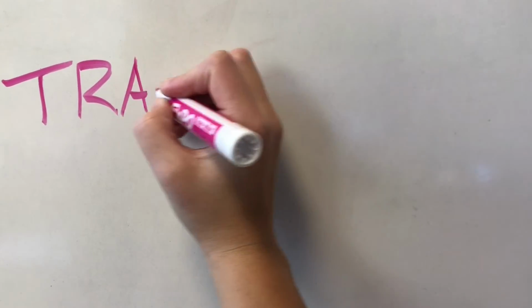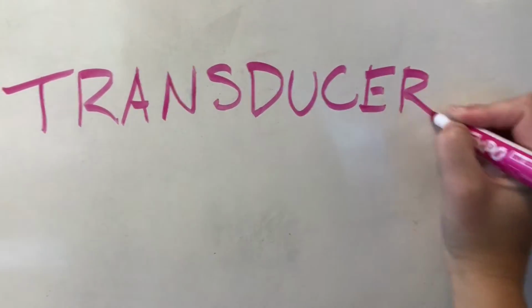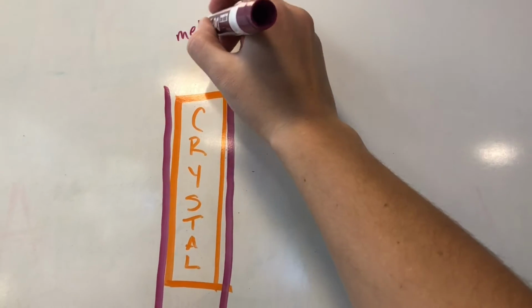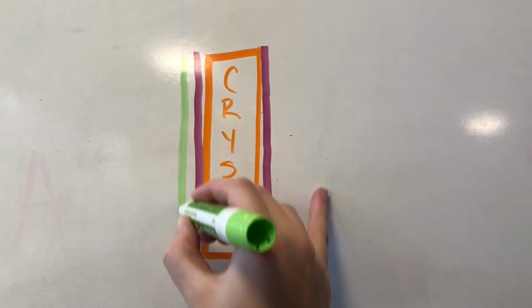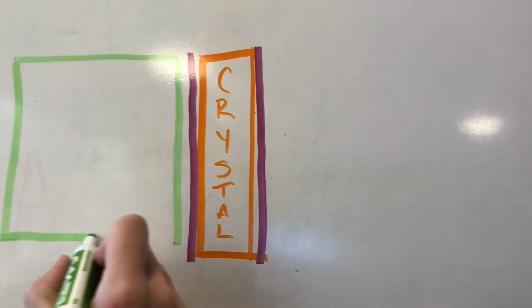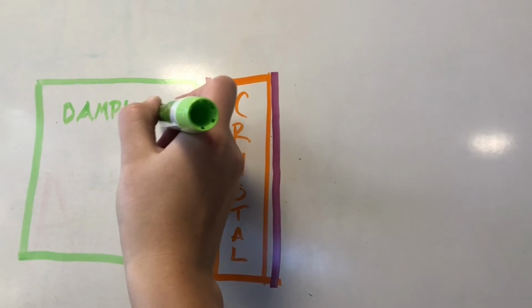Transducers. Transducers are the handheld piece of an ultrasound responsible for production and detection of ultrasound waves. Inside the transducer, there is a piezoelectric crystal and completed circuit. Behind the positive metal plate, there's a damping block. The damping block absorbs ultrasound energy directed backwards and weakens stray ultrasound signals. It creates a shorter spatial pulse length, which allows for better axial resolution but higher bandwidth.